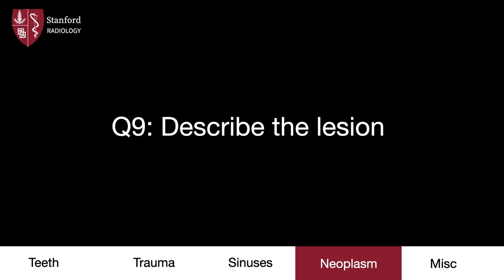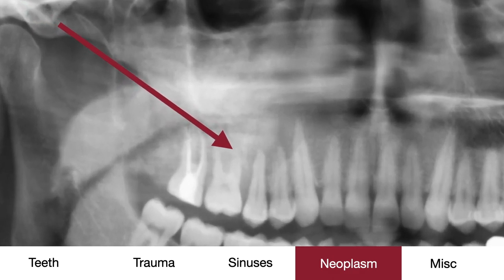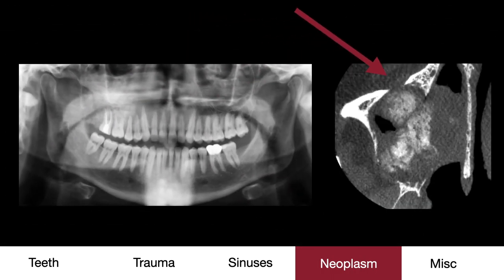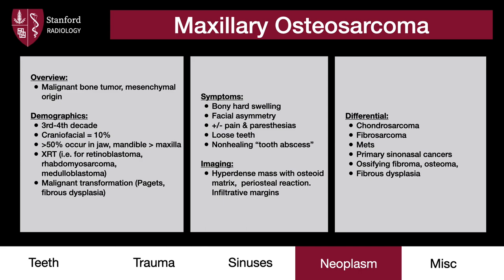Case 9 — describe the lesion. In the region of the right maxillary sinus and alveolar ridge, there is asymmetric opacification. This very well could be sinusitis like we saw earlier, but note how there is involvement of the molar root, suggesting something more sinister. CT showed a heterogeneous lesion with bone erosion and internal osseous matrix. MR highlighted the contrast-enhancing nature of this neoplasm, which was found to be an osteosarcoma. Approximately 10% of osteosarcomas involve the craniofacial region, and of those, half occur in the jaw, with the mandible more common than the maxilla.